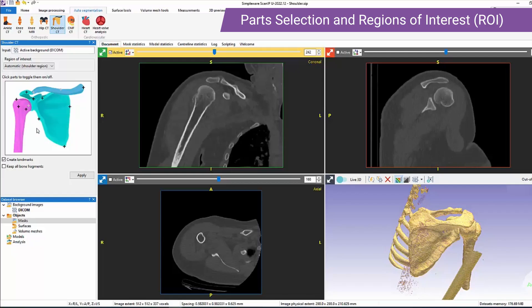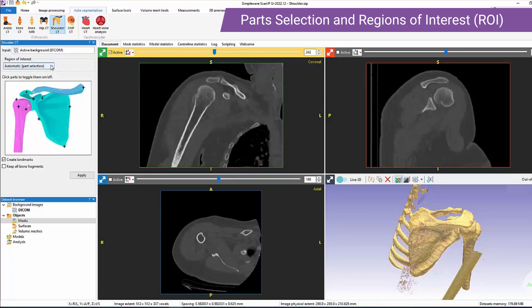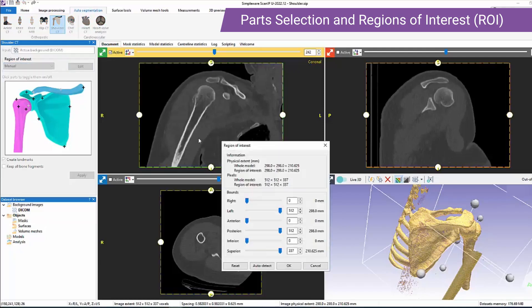The inference speed of the tools is influenced by the volume contained within the region of interest. In most cases, we recommend automatic selection. The automatic part selection is slower to run, but it segments the full extents of the selected parts as shown in the parts diagram. Additionally, we can edit the ROI manually in the 2D and 3D views.